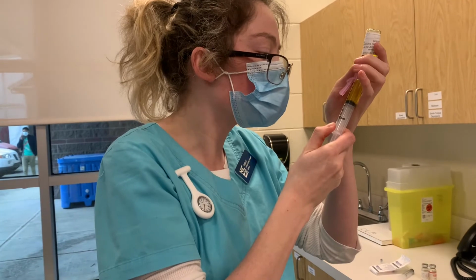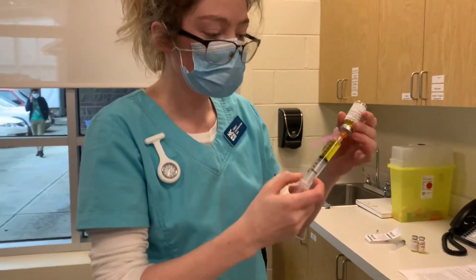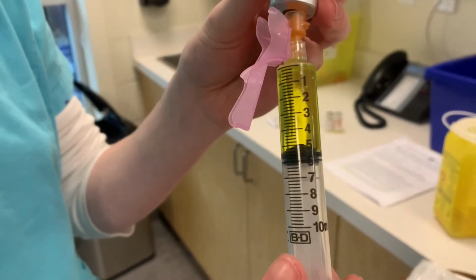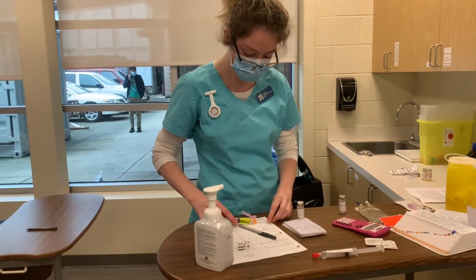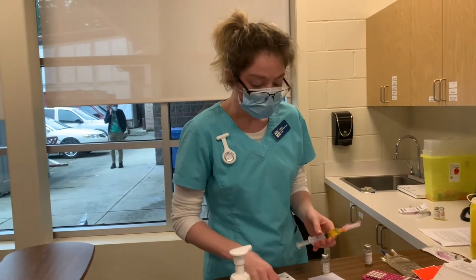There we go. And as you can see, it's right between the 5.2 and 5.4 line. I put the safety cap on again, just to protect myself. And I'm going to do my second check.